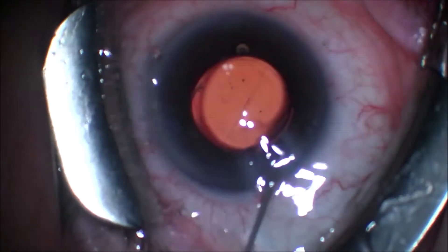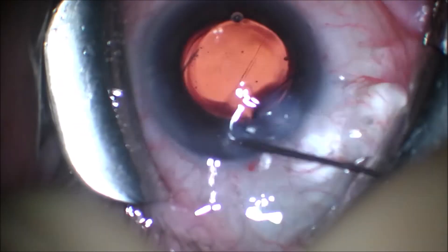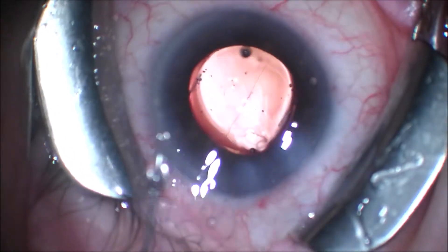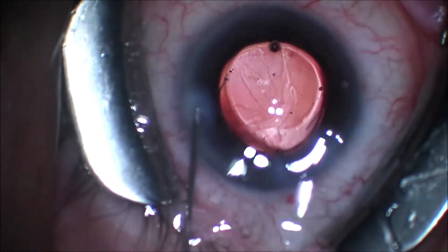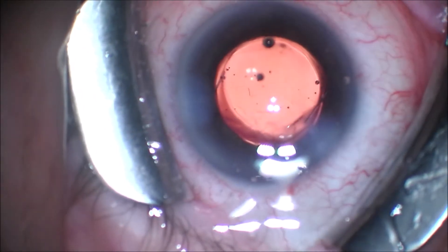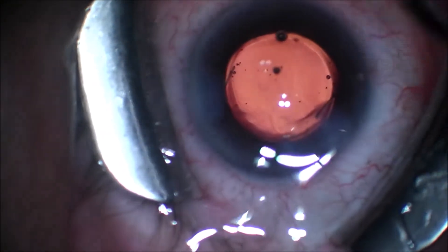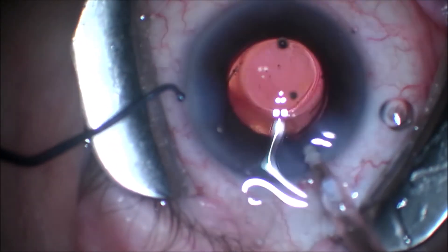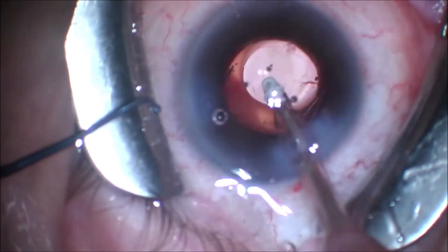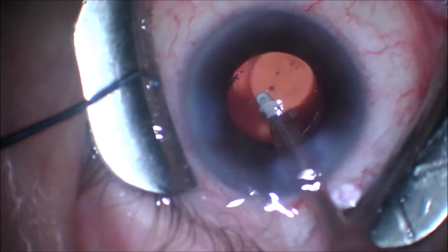We wash the viscoelastic from the anterior chamber angle and perform hydration of the clear cornea and paracentesis wounds before removing the viscoelastic. This allows us to rapidly increase intraocular pressure after removing the viscoelastic to tamponade any bleeding from the iStent injects or the trephination sites.